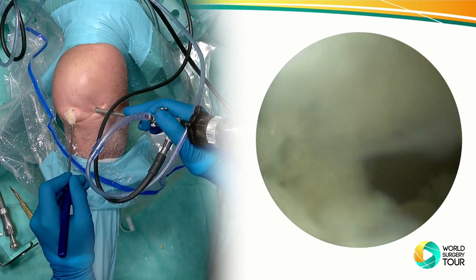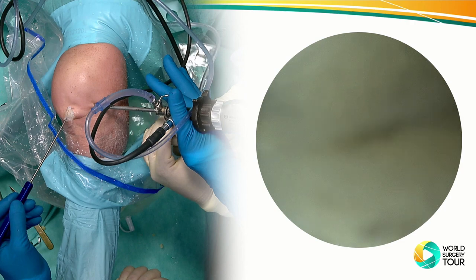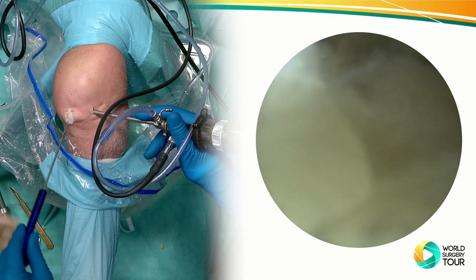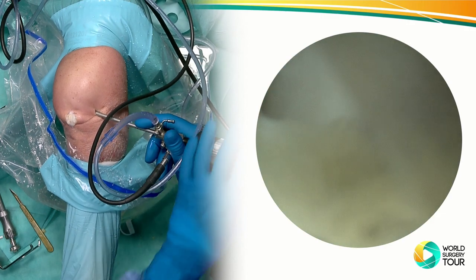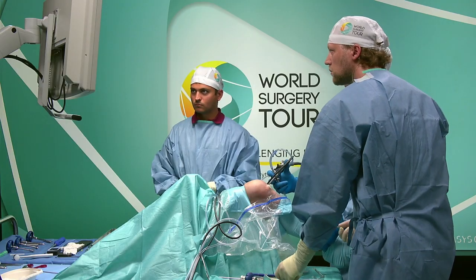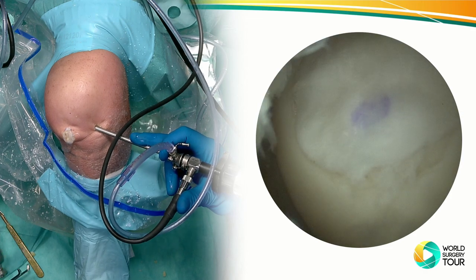Open it. Water came out. All right. Let me get out here. Okay. Here we go. Got it. We can slowly, gently bring it through range of motion. Move it a little bit. Okay, let's put the water on again.